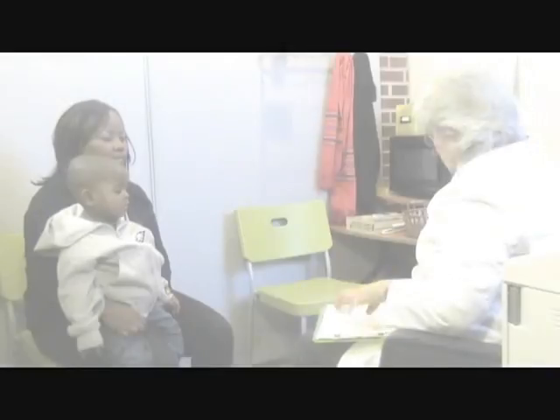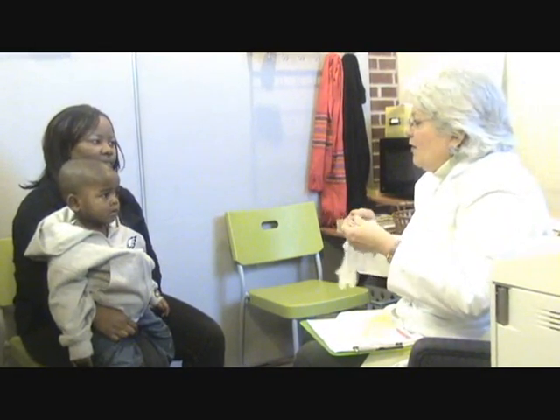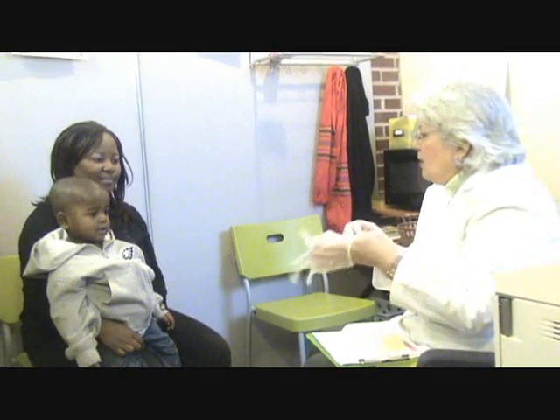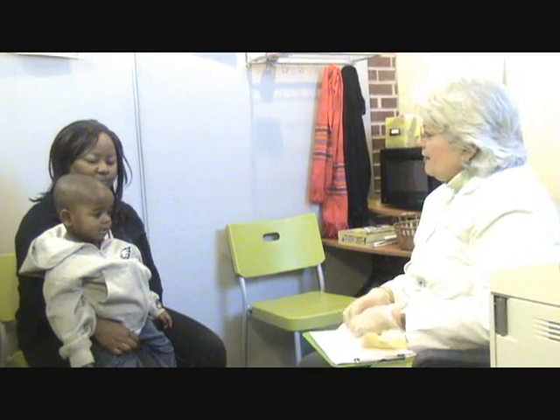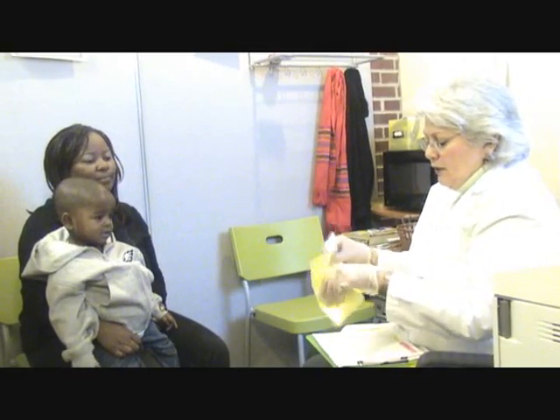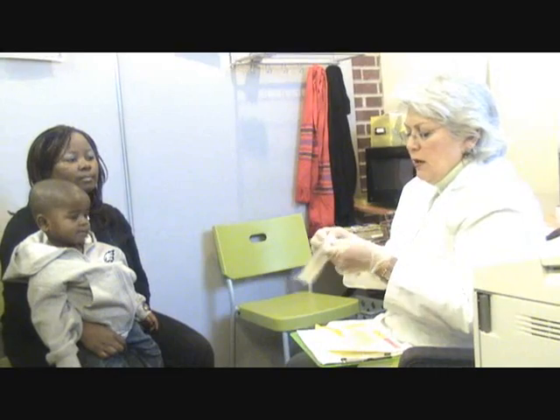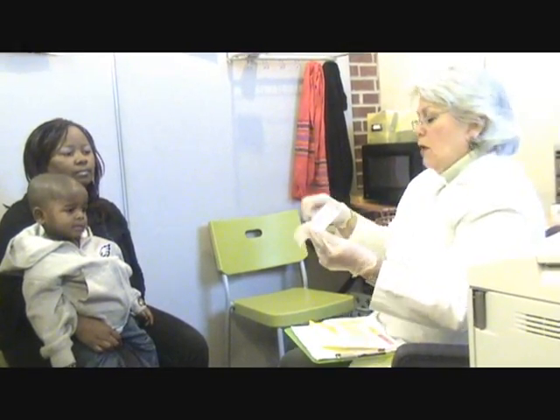I'm going to put on a new pair of gloves. I open the envelope — this is yellow for a child, and it says child's name. Again, I look at the date to make sure it's not expired. I peel at the end so that I know it's sterile, and I'm not going to touch the cotton tip.